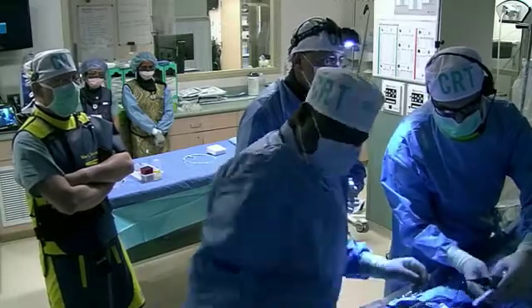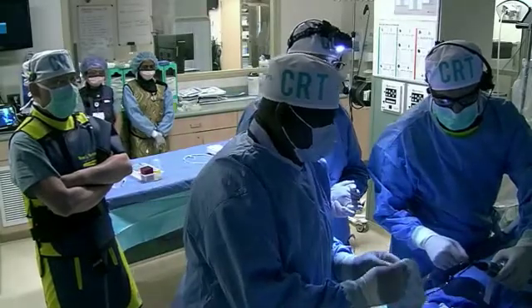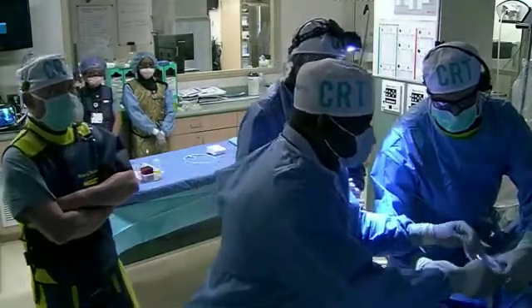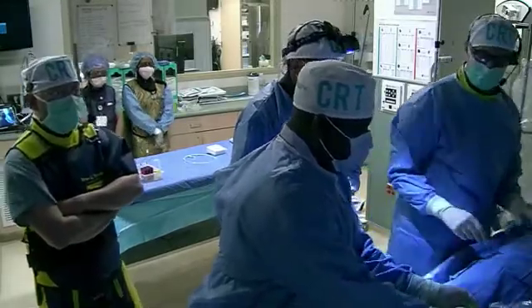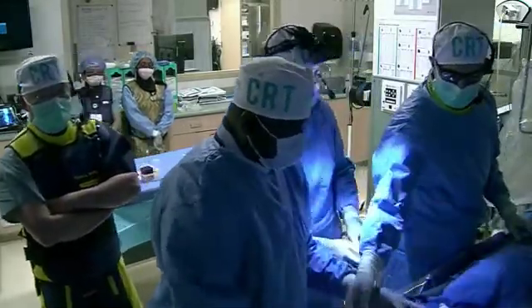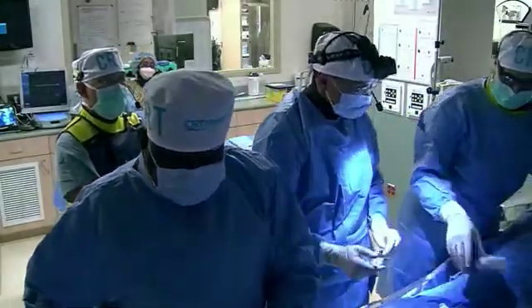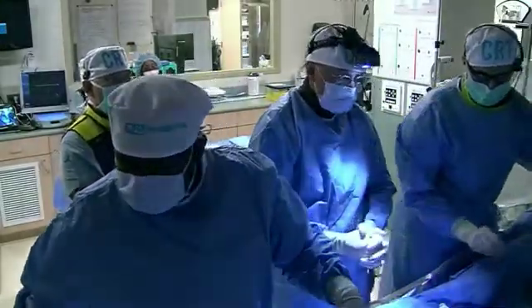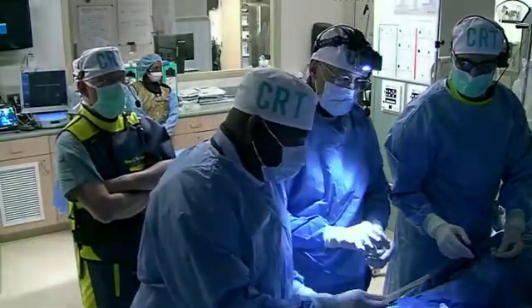Yeah, the plan was this is a live demonstration. We are demonstrating this, but it's nice to see what the balloon is going to do without the energy first. Ron, would you have done it to begin with? I understand what you're doing right now. You have a lot of choices here. I think that starting with the balloon is okay. CSI is okay. There's no doubt there's a lot of calcium.